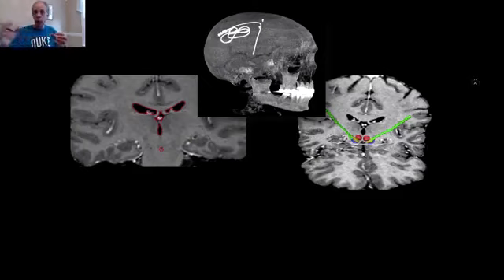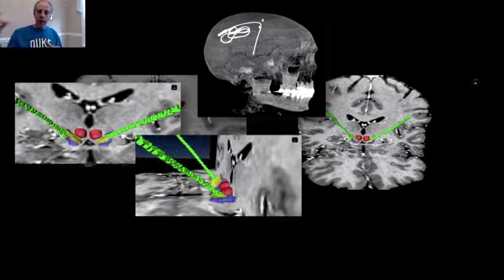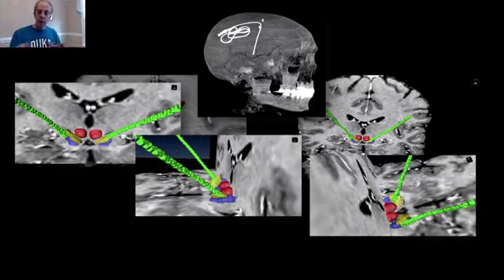For example, one is the tremor. If the tremor stops when you localize the electrode in a certain place and start sending certain electric pulses, then you say, it looks like I'm in a good region there. But to work even further, you can, after surgery, visualize everything that happened. And here is actually real data.